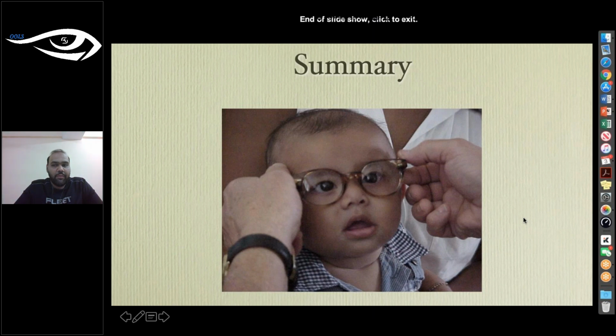Well, again, it's very challenging, as was pointed out. There actually is a technique that has been developed for special needs kids that people on my faculty at the New England College of Optometry have designed, something called a Kong wand. For some of you who remember the old tangent screens, we used to use a black wand, a black stick covered with felt, that would have a target at the end of it that you would use on a tangent screen.